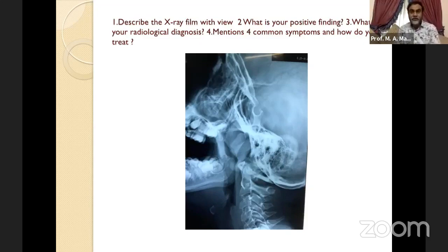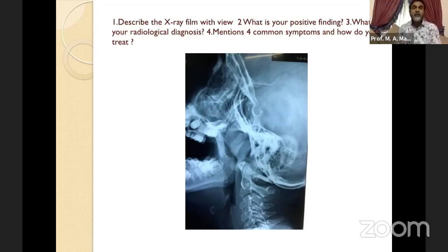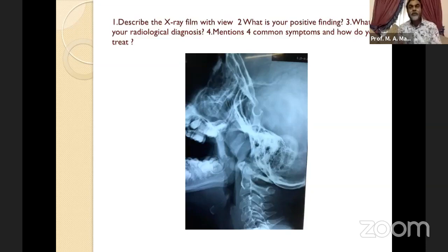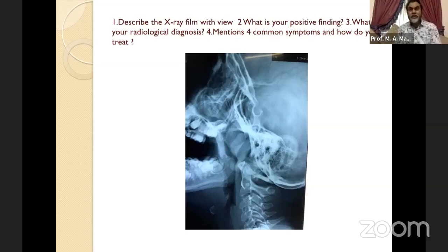To summarize adenoid: enlarged adenoid can lead to otitis media with effusion or OME and conductive deafness. Don't forget this X-ray — it is very important. Regarding differential diagnosis, rather than only asking for the diagnosis, the examiner may ask for two or three DDx. Number one: enlarged adenoid. Number two: antrochoanal polyp — a classic soft tissue mass in the nasopharynx. Number three: juvenile nasopharyngeal angiofibroma. In older patients, consider nasopharyngeal carcinoma.